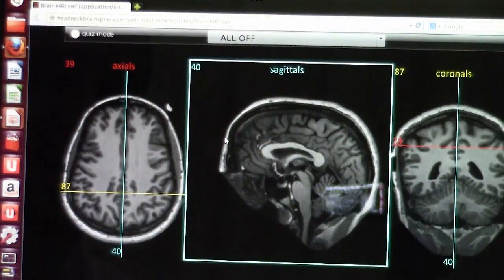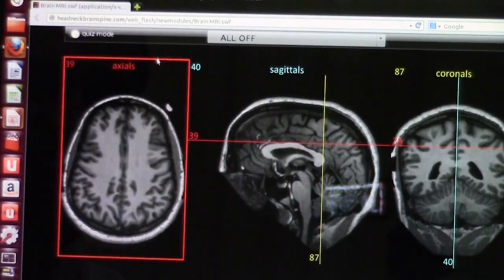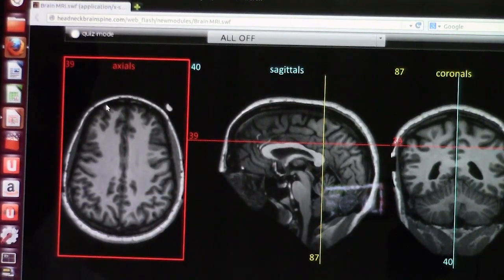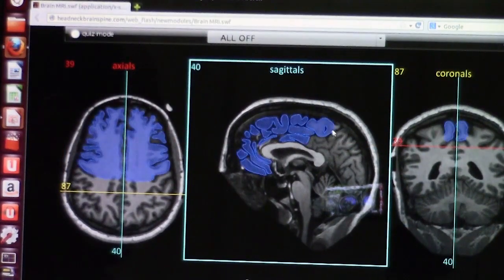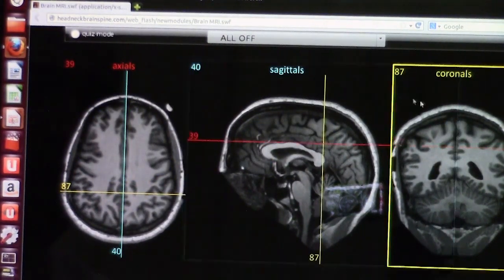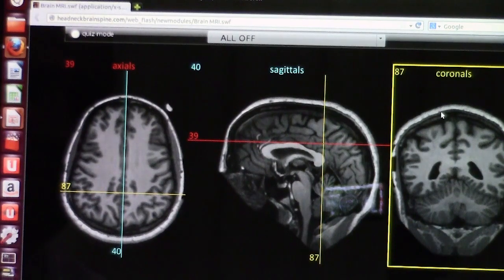Now we talked about the sequences. Let's talk about the MRI cuts. The cuts are the classical axial cut, which is horizontal. There is also a sagittal cut, which is vertical front to back, and a coronal cut, which is vertical left to right. Each cut is helpful to look at certain structures of the brain.